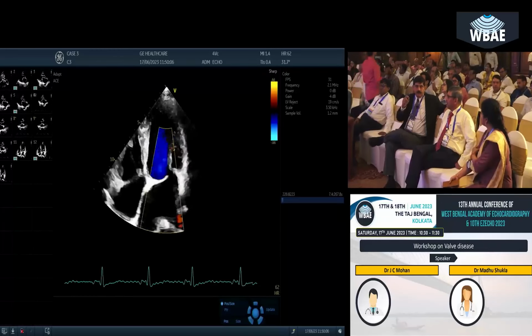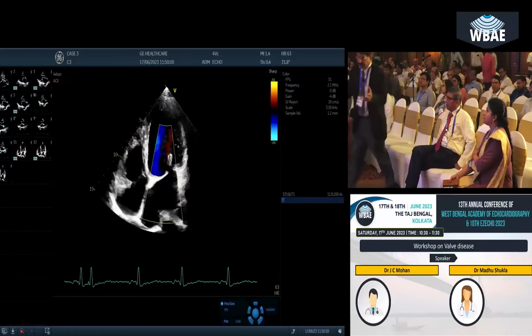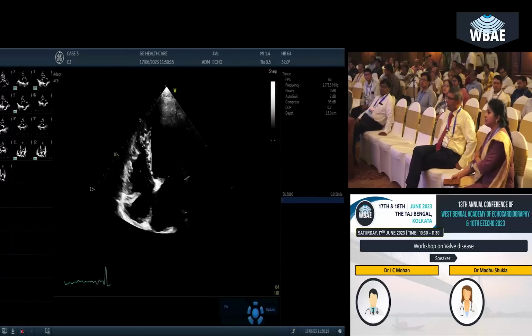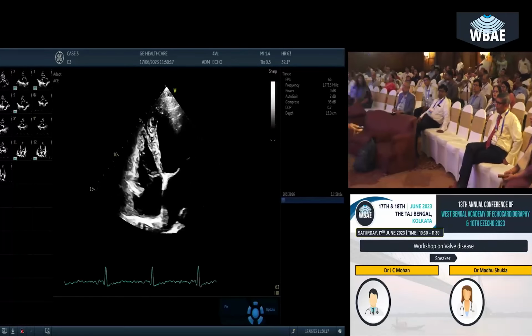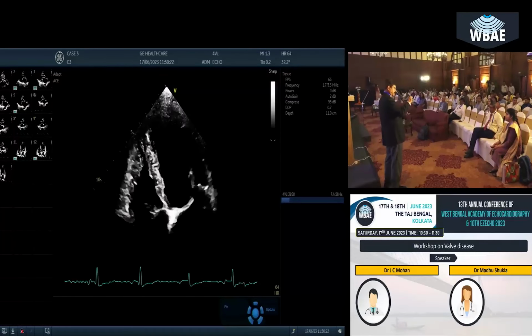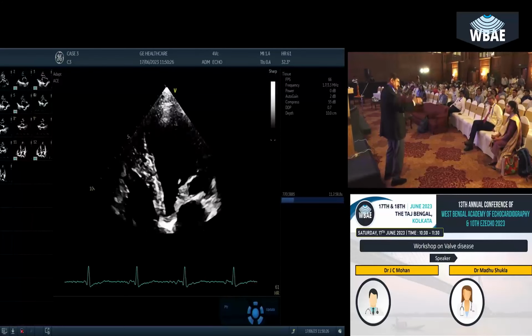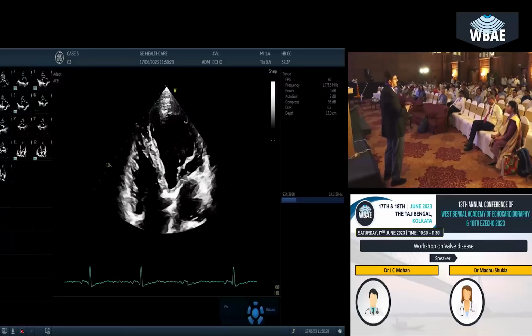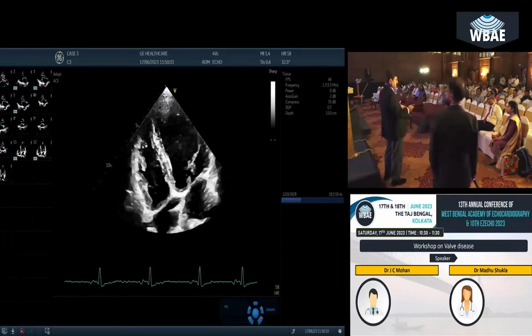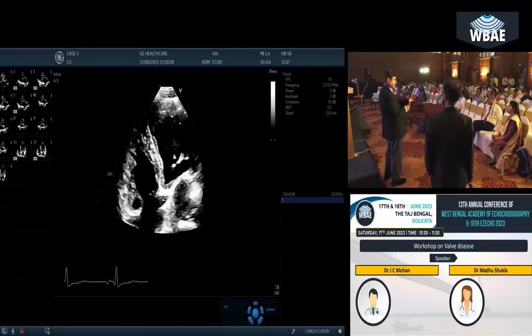Measure both the maximum diameter and the minimum diameter, and average the two. That is why the transthoracic LVOT or annulus doesn't correlate with the CT, because the annulus is oval. In the parasternal long axis view you are getting the minor axis, not the major axis, so you will always get a shorter value. To sort it out, go to the short axis view at the level of the annulus and measure it with 2D.